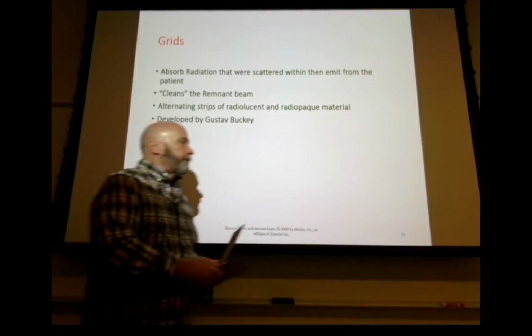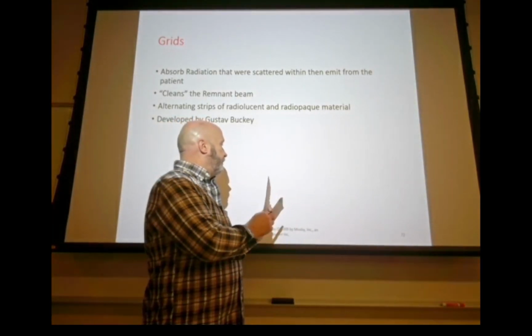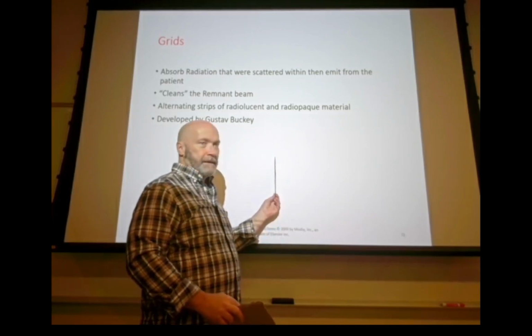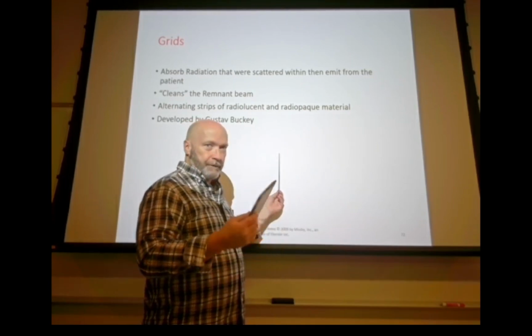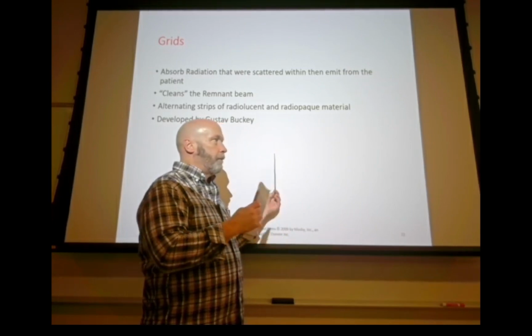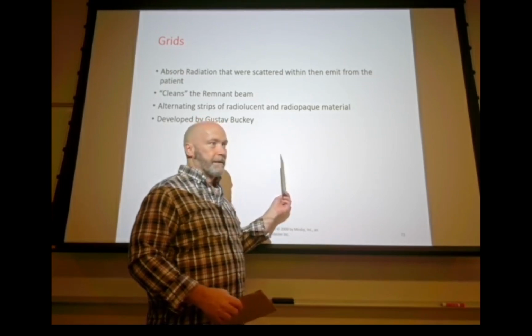So that what we get then, if we were to be able to visualize the grid strips, they should appear very, very thin, okay? So the effectiveness of the grid, we'll talk about all the different measures of the effectiveness of the grid, but in as much as not wanting to be able to visualize a grid, we need those grid strips to be very, very thin.